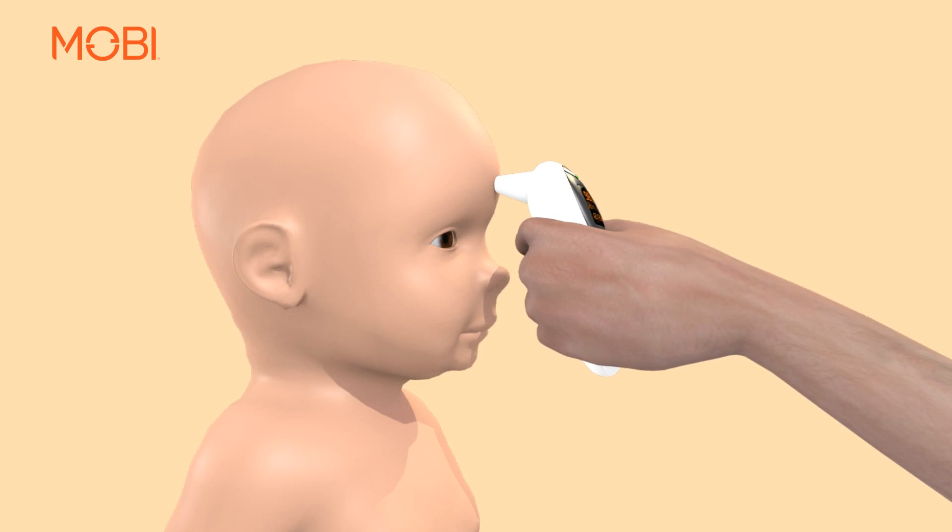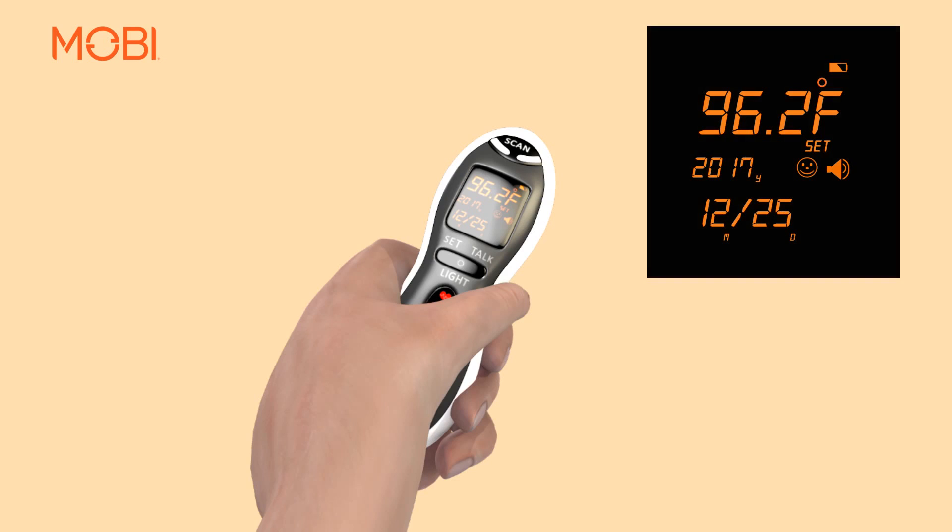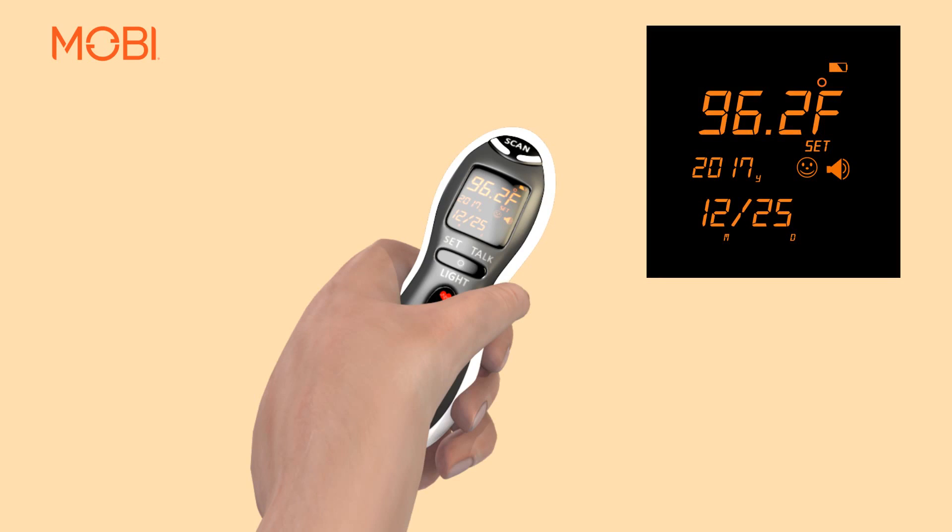Once you hear two beeps, the body temperature will be shown in large numbers, either in Fahrenheit or Celsius, depending on the settings.